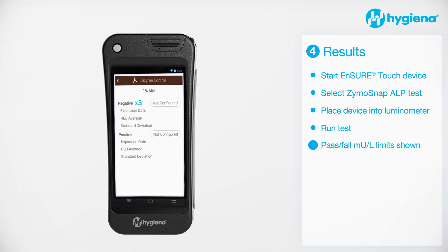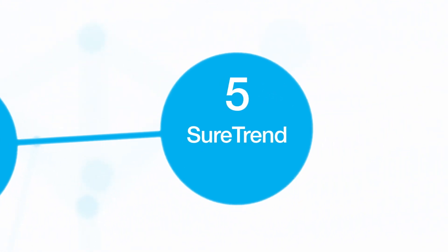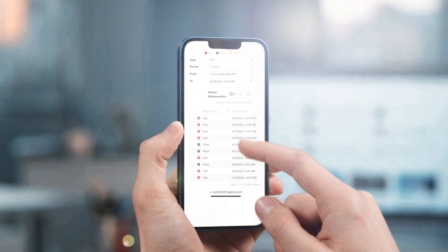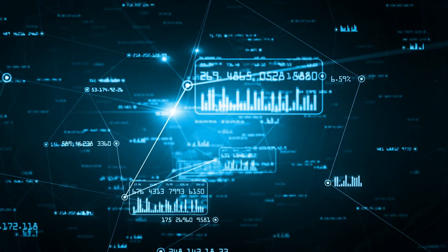Pass-fail limits for your specific milk type are determined by using the ZymoSnap ALP positive control kit. Use SureTrend software to get the most out of your monitoring system, enabling you to see all of your test results in one place.